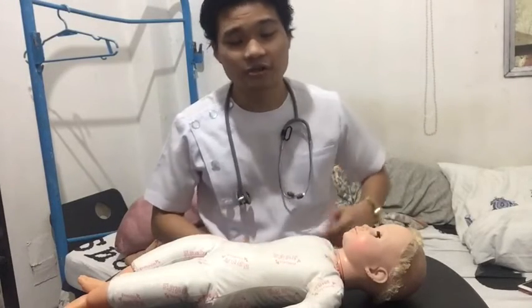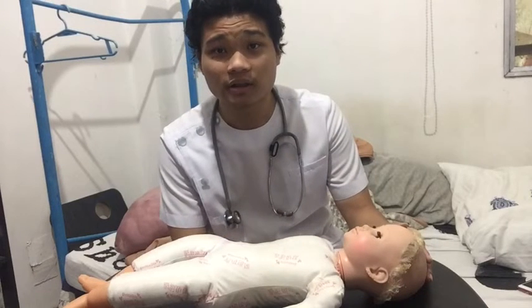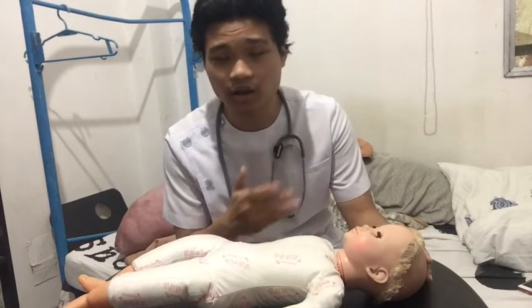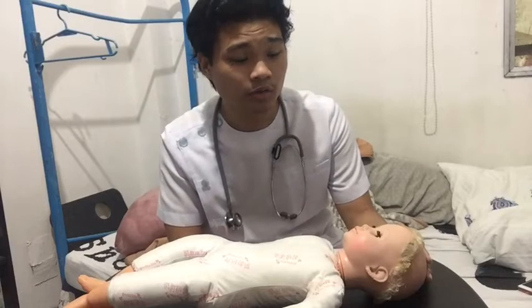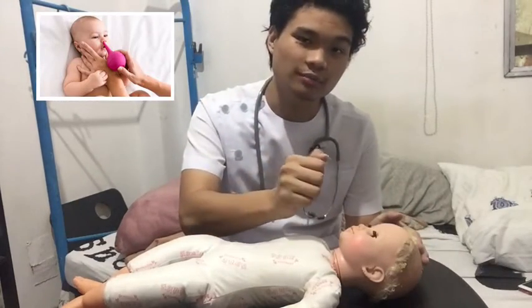And after assessing the respiratory status, the asymmetry of the chest, and also the lung sounds, what we're going to be doing is we're going to be assessing if there's any mucus secretions in the client, wherein it's needed for the aid of oxygen. If there's any mucus blocking airways that gives the client difficulty breathing. Now, what we usually do is we let the client cough, and after letting the client cough, since I do not have a mucus suction bulb, what they do is they press on and they suck out the mucus of the client.